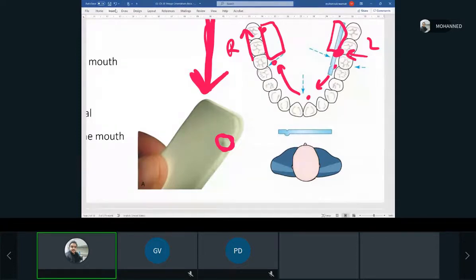So you can see the dot on the X-ray. Well, with the film ones, you can feel it with your finger, and with the phosphor plate, you'll see it as a letter on the X-ray also. It just helps you with that orientation, okay?